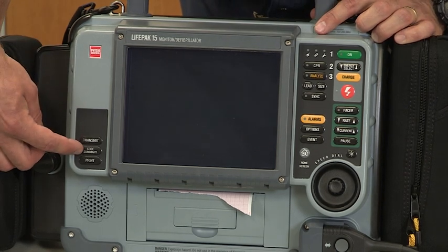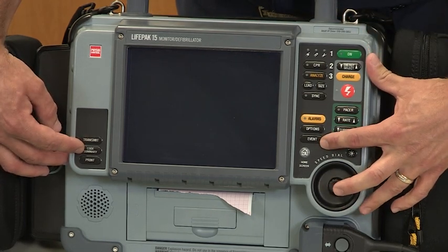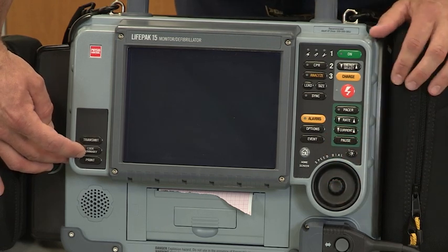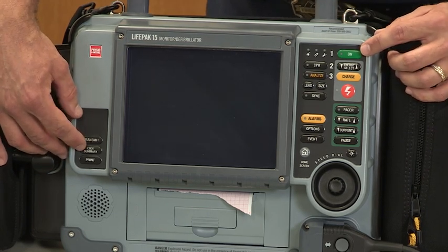The other button we already talked about earlier was the code summary. If you choose to use that, if you've put an event in, such as administering aspirin, nitroglycerin, oxygen, and you'd like to print that code summary, you have to do that before you actually turn the device off. Otherwise, it'll erase all that data that you've put in there.